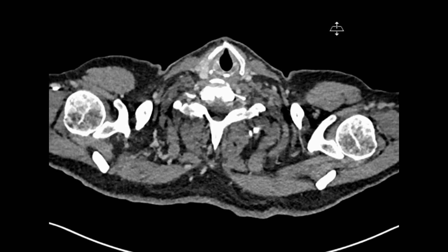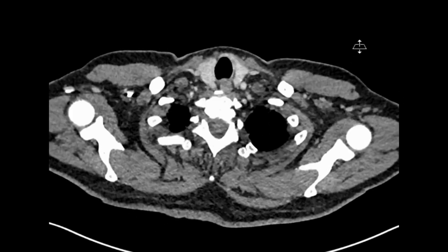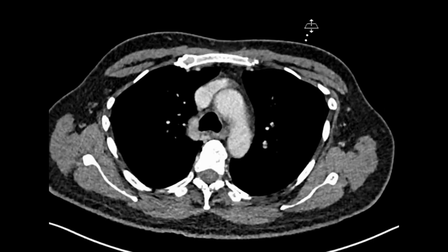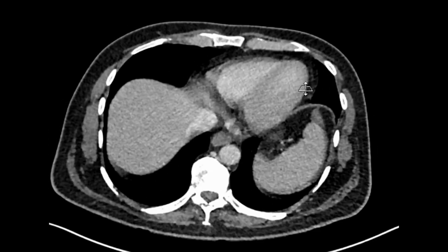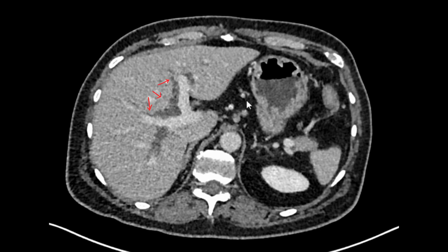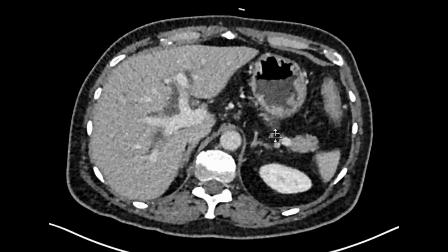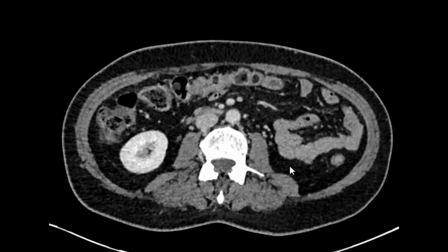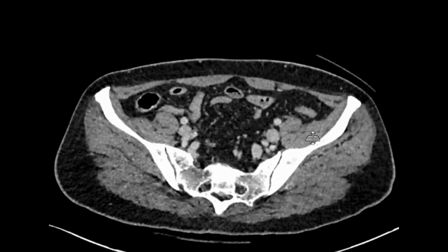Let's start looking at the scan now. Generally when I start looking at a scan where I have no clue where to find the primary — although in this case I have a suspicion it will be something related to the biliary system — I scroll down rather quickly to find any gross abnormality. Here you can see there is a dilated biliary tree. I'll ignore it for a moment and keep looking for any other gross abnormality.